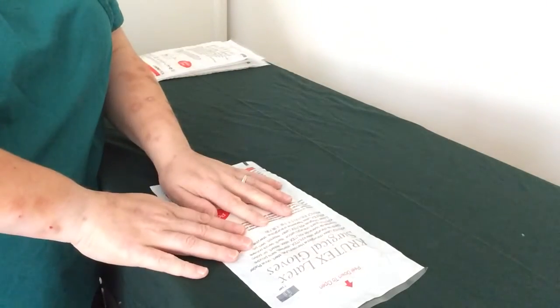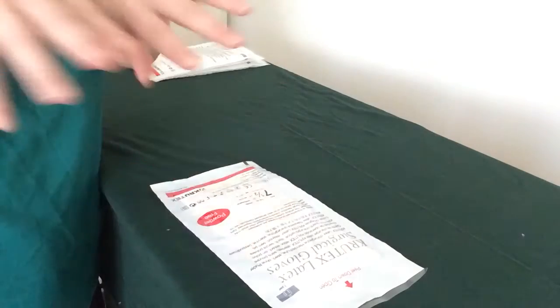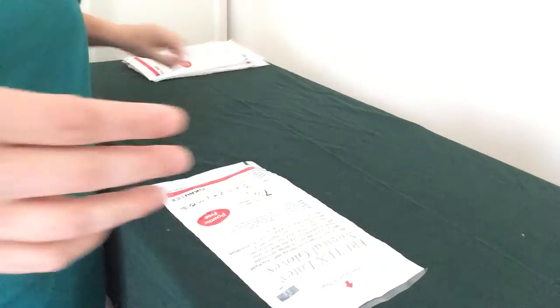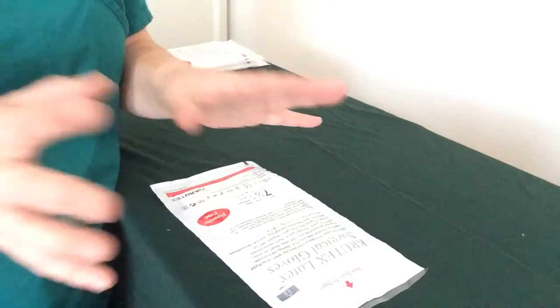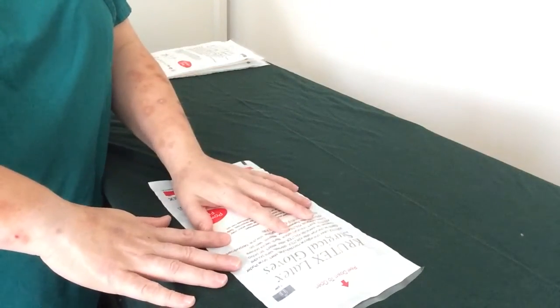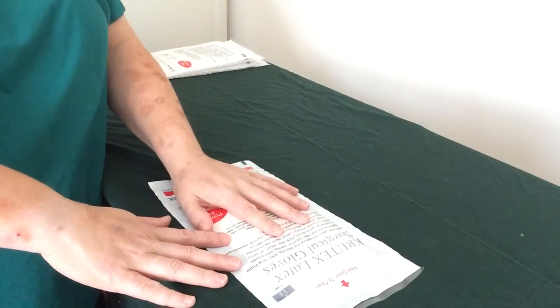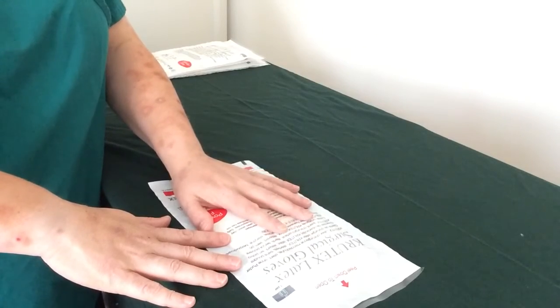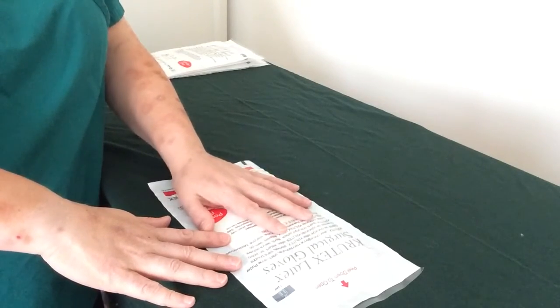So before we start, I'm going to make sure I have clean fingernails, I have short fingernails, and I have no jewellery. I know that jewellery is special — it might be a wedding ring, engagement ring, or friendship ring — but for the sake of your OSCE exams, just take it off for the whole session. Don't fail because you forgot jewellery.